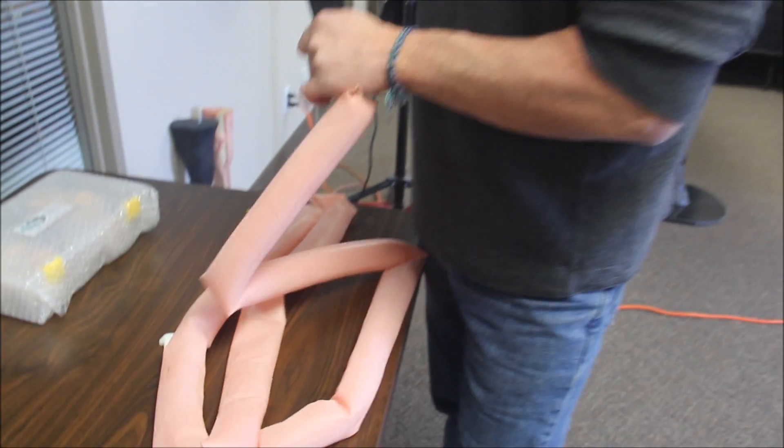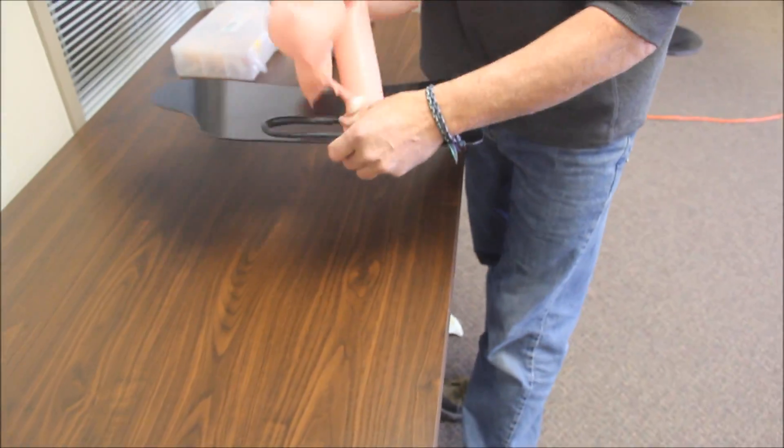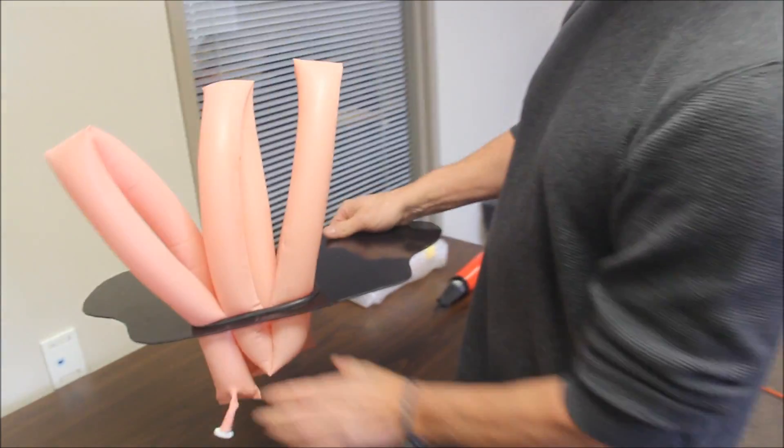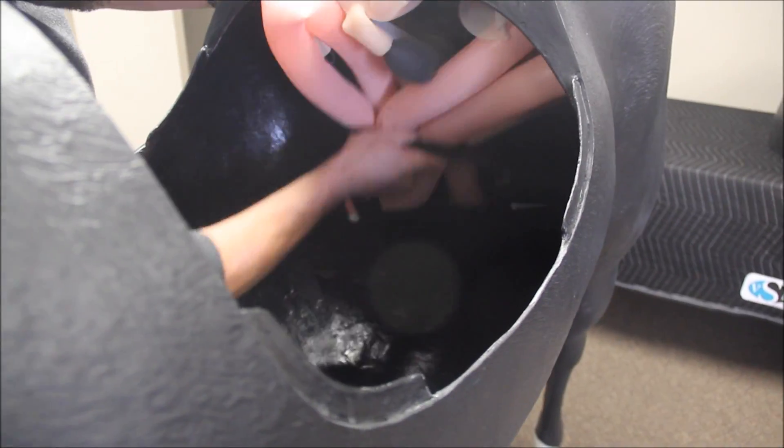A 3-meter long latex tube represents the small intestine and is inflated with the provided pump. Be careful not to over-inflate the intestine. Three loops are created and pulled through the small intestine mount, which is then placed inside the horse body.